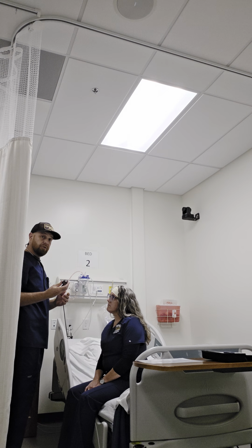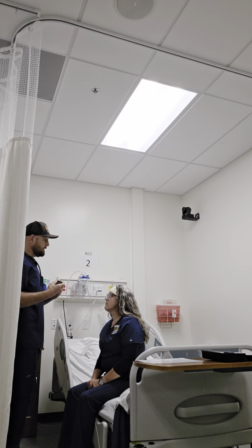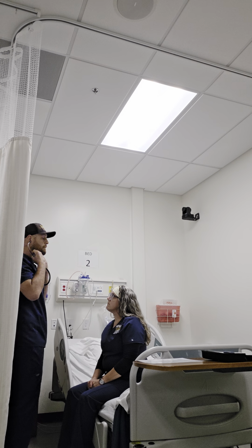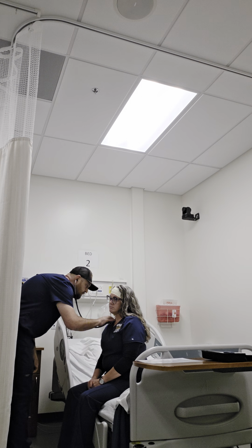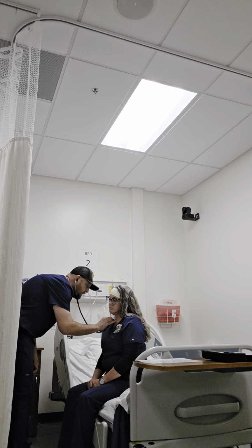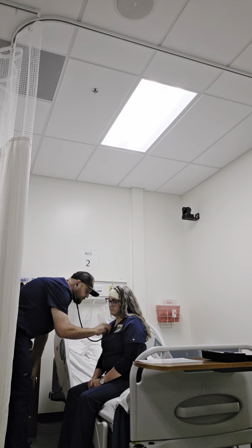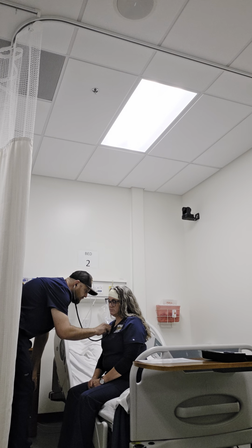So I'm going to move a little bit quicker here, but again, just to walk you through it, we're going to go ahead and do everything that I just did, but now we're going to do it with the bell. This is going to help me assess your S3 and S4. So again, we're going to do my collarbone. It's the second intercostal space.